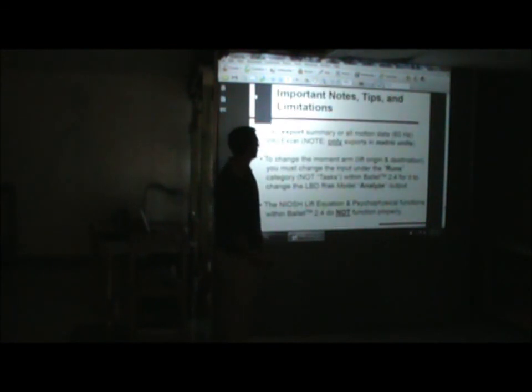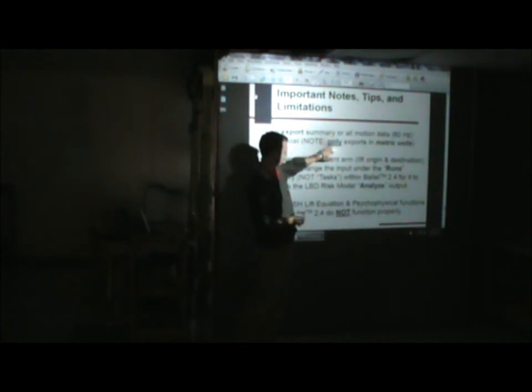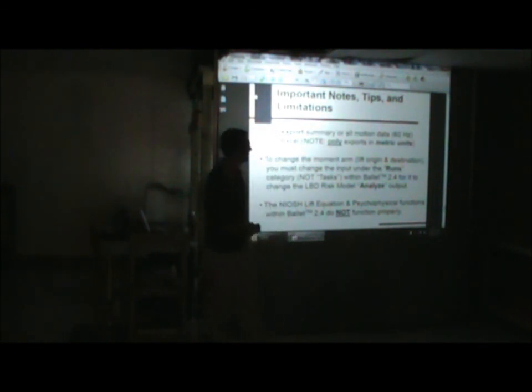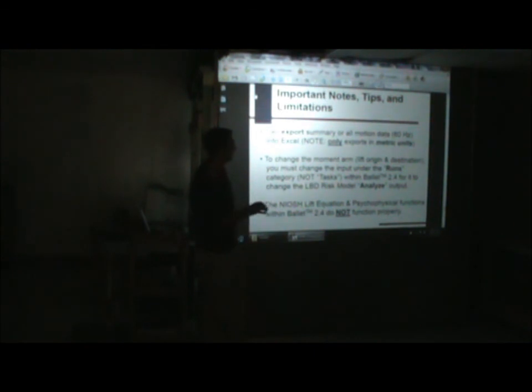Okay. And like I said, you can export either a summary or all of the motion data that's captured over the runtime, again at 60 hertz, into an Excel document, and I'll show you how to do that. However, one thing I noticed, we've just received this, so we haven't had it very long. I was running some tests the other day, and it only exports in metric units. So for your moment, it outputs in Newton meters, so you have to do some conversion. I just wanted to throw that out there.